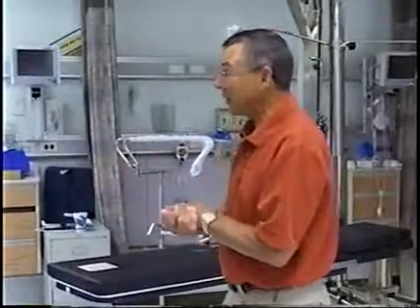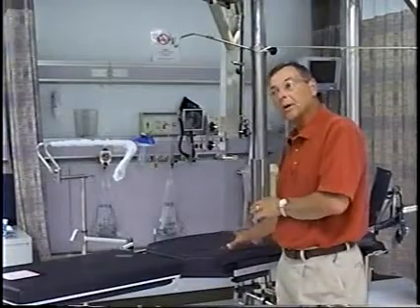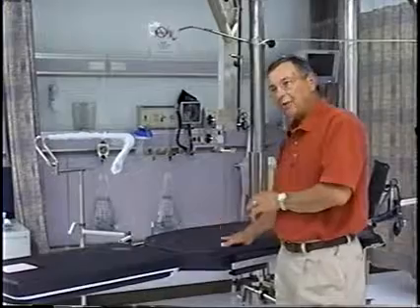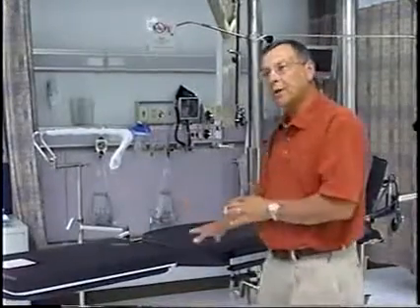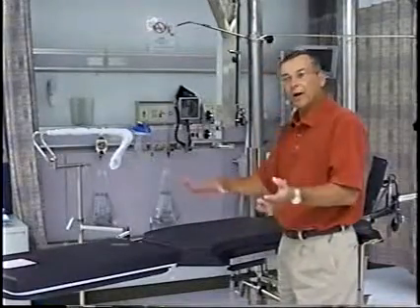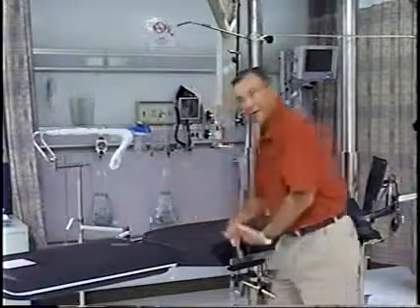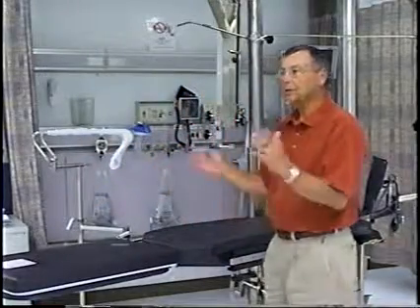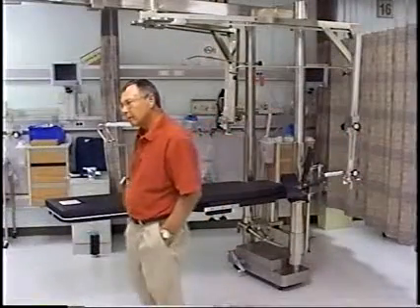Maybe because the majority of the population is right-handed, I don't know. But the majority of fractures occur on the left side of the body. So if you keep it set up to do a left hip, all you have to do when you come in, and I'll show you how to put it in the storage mode, is set up for a left hip. If it is a right hip, all you have to do is change everything. You put the well leg over here, you put the traction device on the right, and you can do it in 2 minutes.